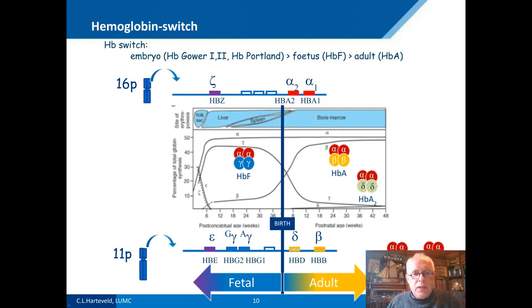The hemoglobin switch is an important thing to understand if you want to know what hemoglobin types you can see at the separation level. So if you are using capillary electrophoresis or HPLC for detecting hemoglobinopathies, it's good to know about the switch.